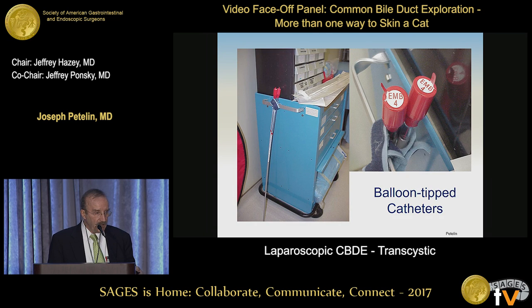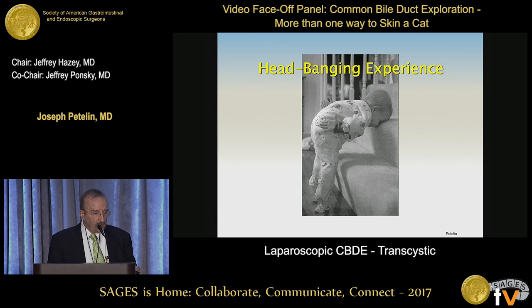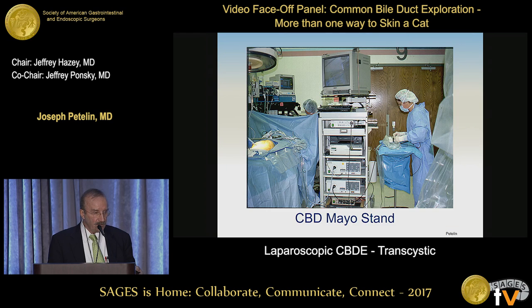We've gone through what we needed. Those are the 4 French Fogarty-type vascular catheters, not the biliary catheter. And then the Segura straight wire basket, it'll fit through that medial port as well. And that all can be a head-banging experience if you don't organize it on a common bile duct cart. That relieves a lot of angst for the nurses and the surgeons.